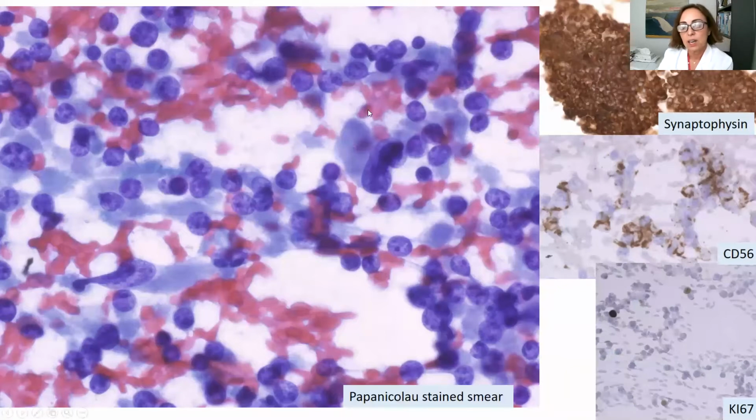And this is another case. You can see here the differences in size of the nuclei, which is a characteristic of neuroendocrine tumor, as you know, and the delicate cytoplasm that is in different amounts in different cells. In this case, the tumor is strongly positive for synaptophysin, focally positive for CD56, and I won't talk about the big issue of Ki67 in cytology in neuroendocrine neoplasms. This is for another topic.